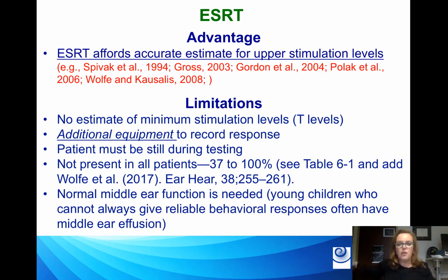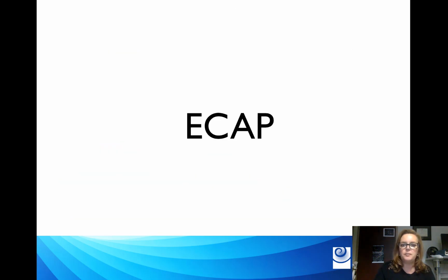Again, I sort of feel like I need to grow an extra set of arms, because you're like, stimulate, go, trying to keep the kid from moving. Older children, preschool to school age, piece of cake. Give them an iPad, let them watch a movie, have them be relatively quiet and still, that is great. Toddlers, it's difficult. It absolutely is difficult. So these are the limitations.